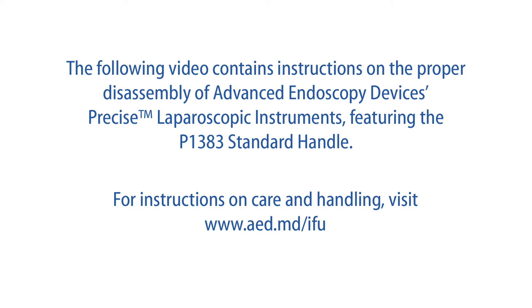The following video contains instructions on the proper disassembly of Advanced Endoscopy Devices Precise Laparoscopic Instruments, featuring the P1383 standard handle. For instructions on care and handling, visit www.aed.md.com.